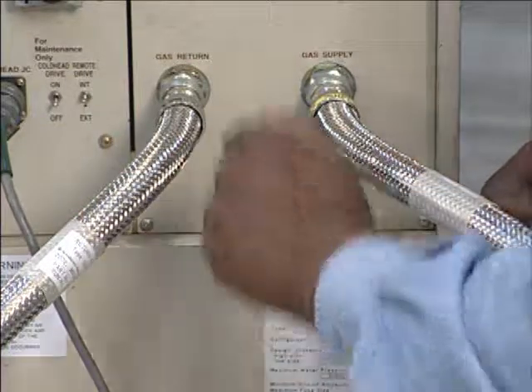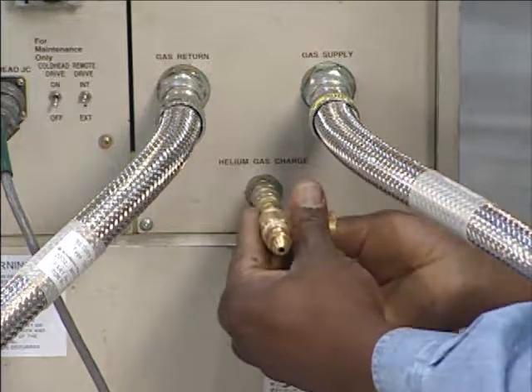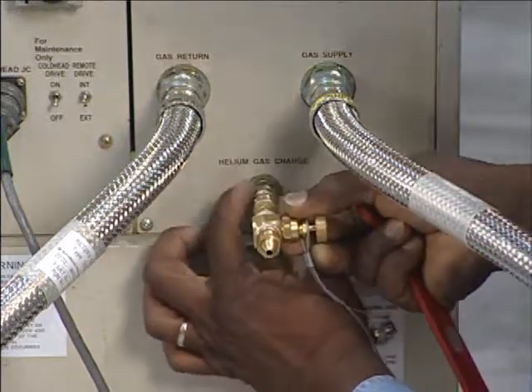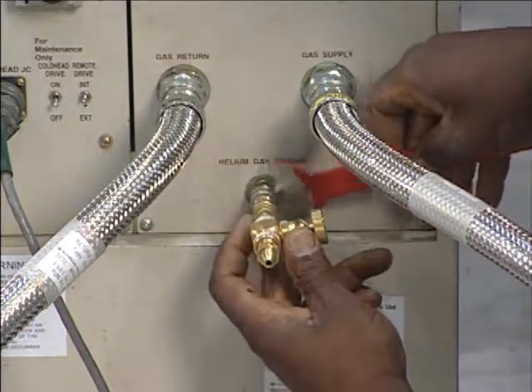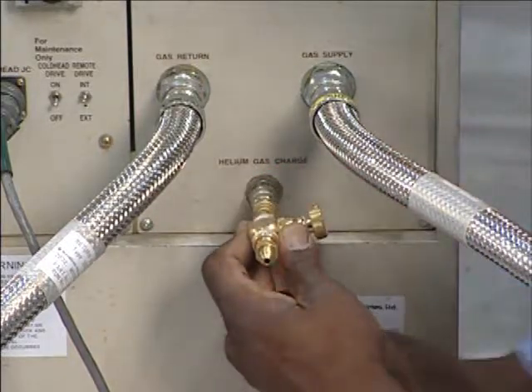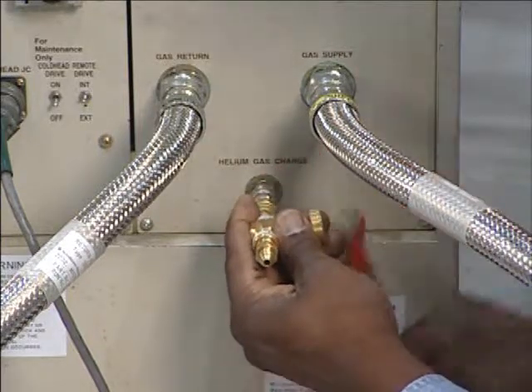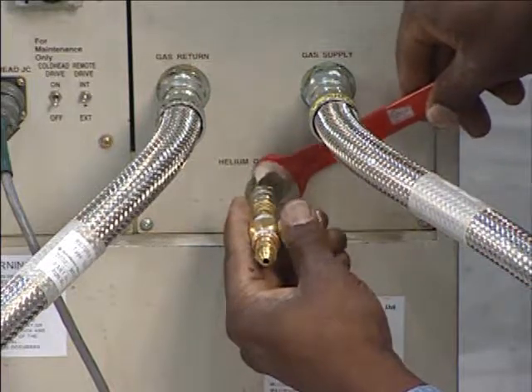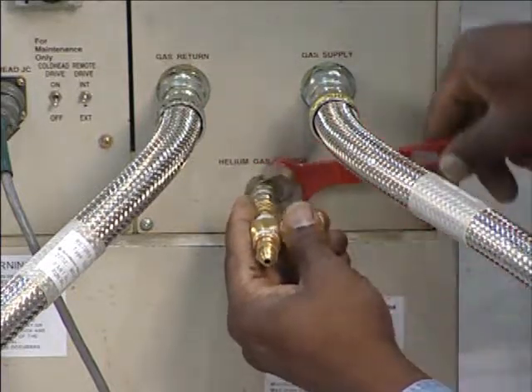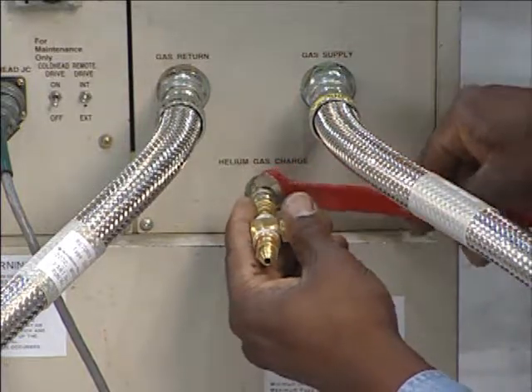The next step is to install the charging valve to the compressor helium charge fitting. Slightly open the gas charging valve. This allows a small amount of helium from the compressor to escape at the connection, purging any atmosphere from this area, before closing the valve.